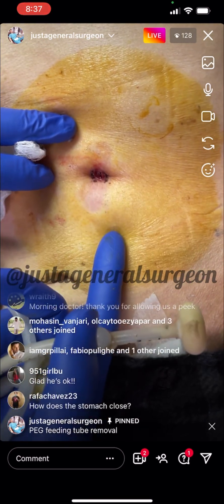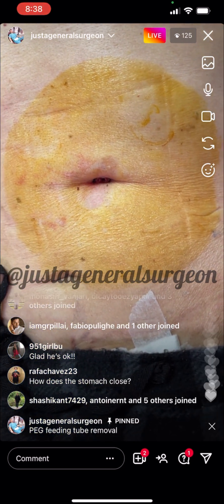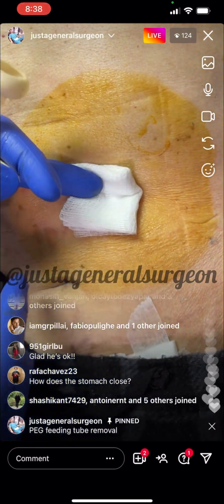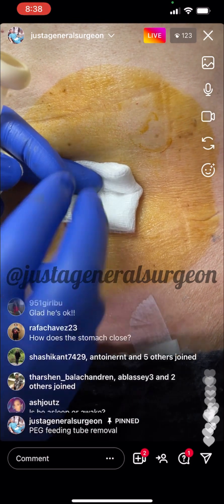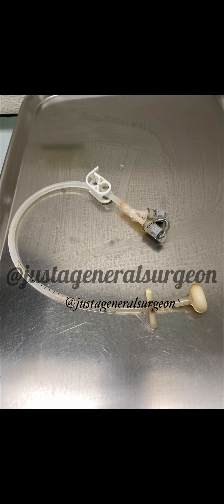Sometimes some gastric juices come out — nothing of concern. It will all heal up on its own. As long as the patient has enough nutrition, this heals by itself. Just keep it covered. This hole will heal up in the next couple of days, so there won't be any leakage if there is any. He'll come back for a two-week follow-up.